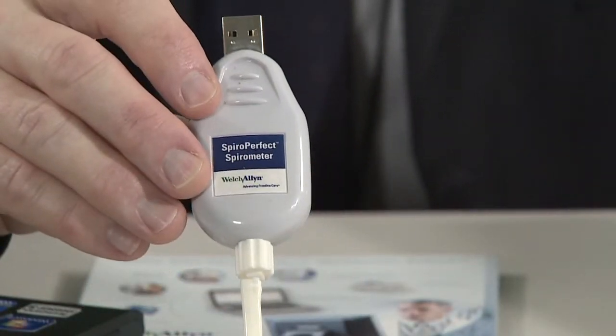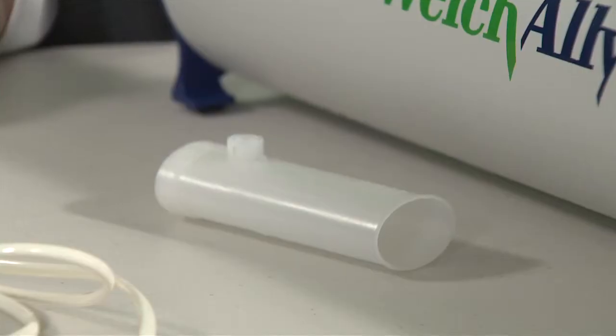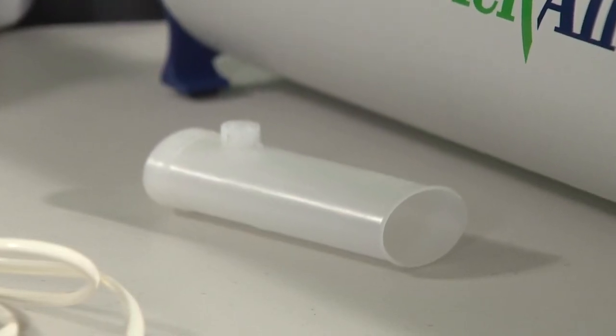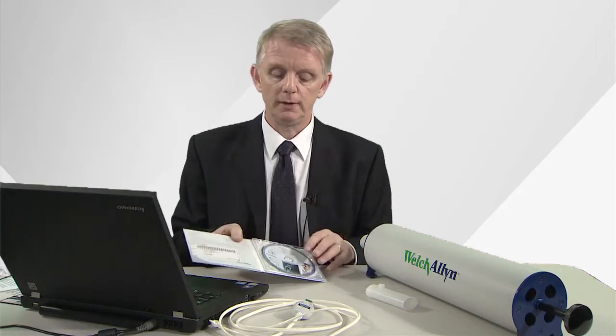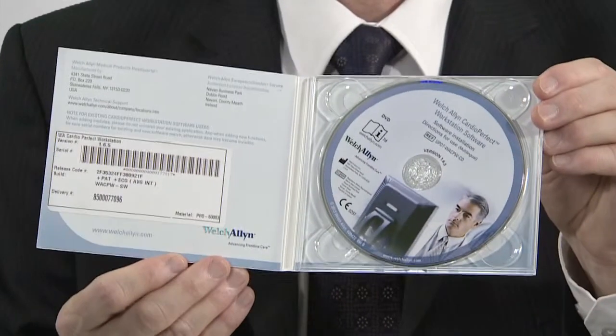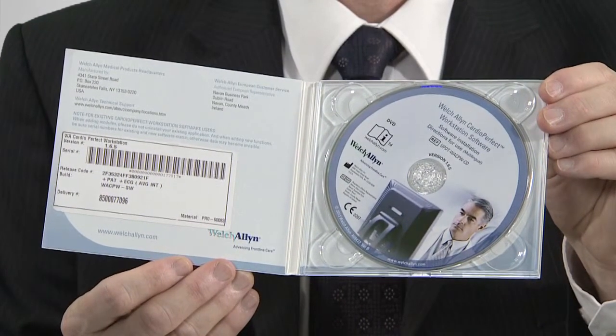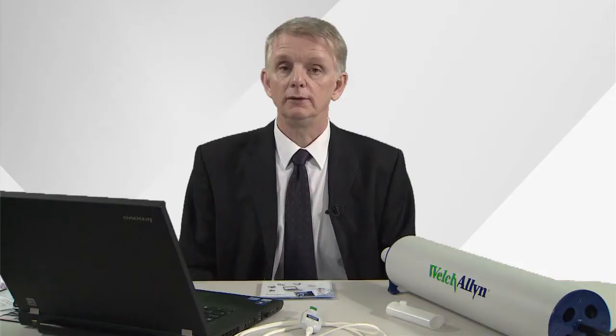But first, let's look at the components. When you buy the spirometer you get a USB connection with tubing, disposable flow mouthpieces for the patient to use, CardioPerfect software which should be loaded to your PC or laptop, and finally a 3-liter calibration syringe. You should calibrate your spirometer once at the start of each day of use.